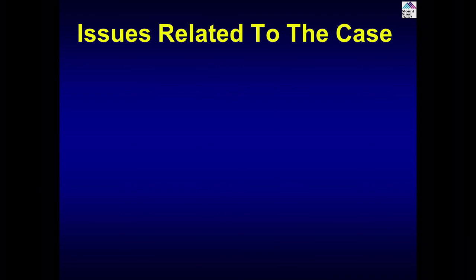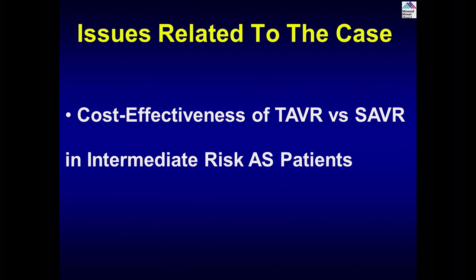Latest point next. Remember, TAVR has been hailed as a more expensive technology over surgical valve replacement, and also the profit margin for the institution because of the cost involved. The biggest cost, as we all know, is the cost of the valve, which is between 30 to 32,000, compared to surgical aortic valve, which is about 5,000. So clearly, for TAVR to be cost effective, you had to take care of the six-time cost, whether by decreasing the length of stay and ICU stay and decreasing the complications.